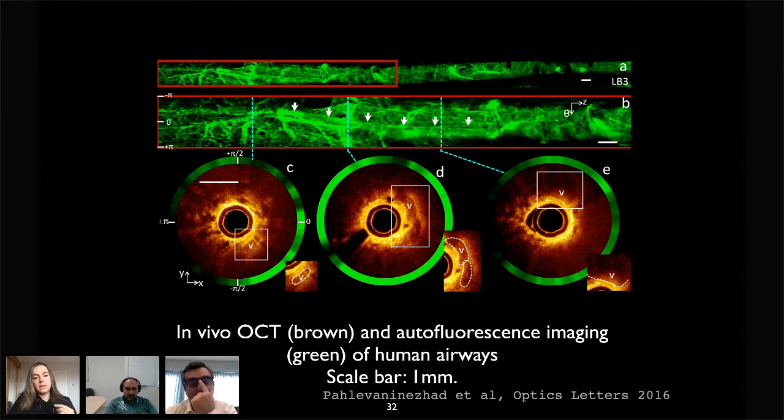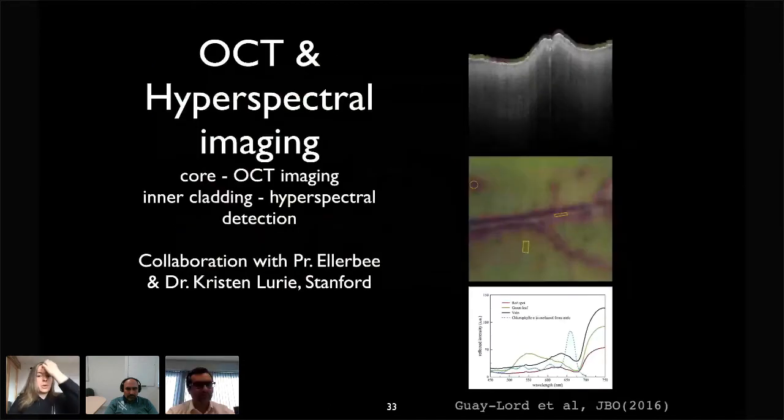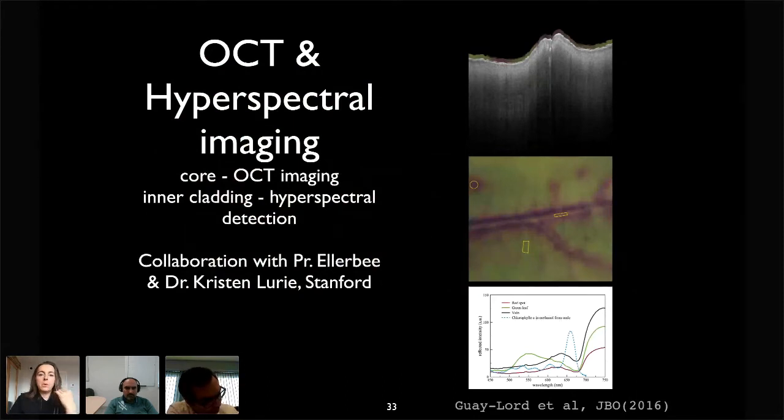It's really excellent research. Back in Montreal, we're also showing new applications for this coupler. Again, OCT, but this time we ask ourselves, in addition to having the depth information with OCT, can we show the color? Because most clinicians have been trained with color their entire life, right? With the different shades of red, they can tell inflammation, and different shades of yellow and green, they can tell infection. So we started with a plant in my office.